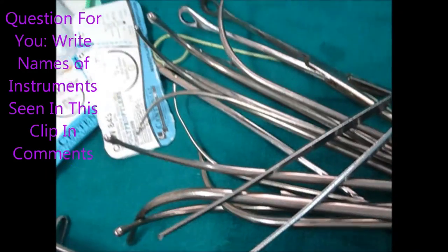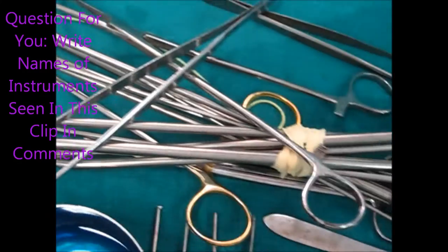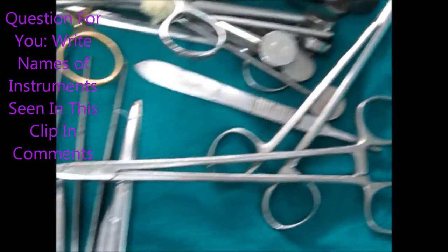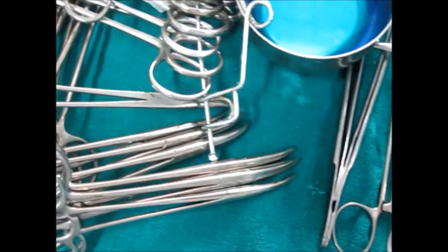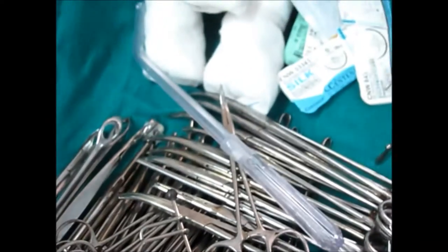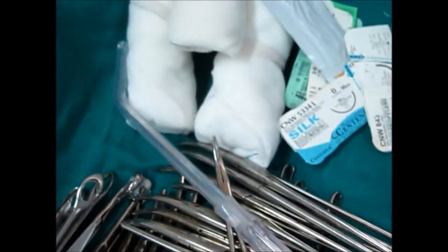And now the question is for you. These curved ones — what are they called? If you can write the maximum number of instruments shown in this clip, write it in the comments below the video and get some prize.